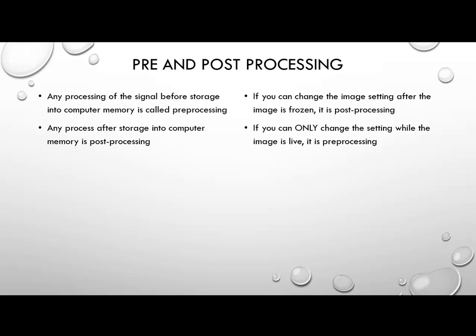That makes it simple. Now, in the old days, and you may see questions like this, they considered pre- and post-processing differently. The pre-processing was the signal before it got to the scan converter, and post-processing was the signal after the scan converter. So the scan converter was in the middle of the system, so to speak. Today, that's no longer true. We can do a lot of our pre- and post-processing on things that are before and after the scan converter. Alright, and the scan converter is not at any particular spot anymore in our systems.